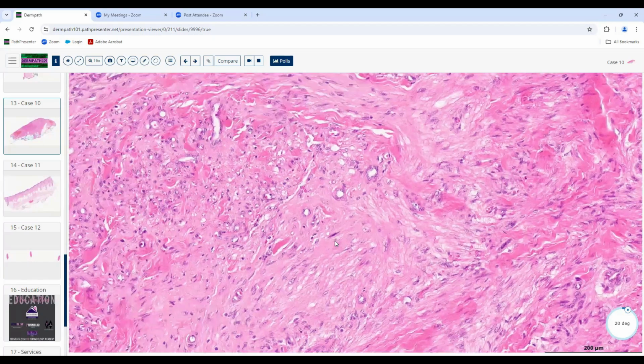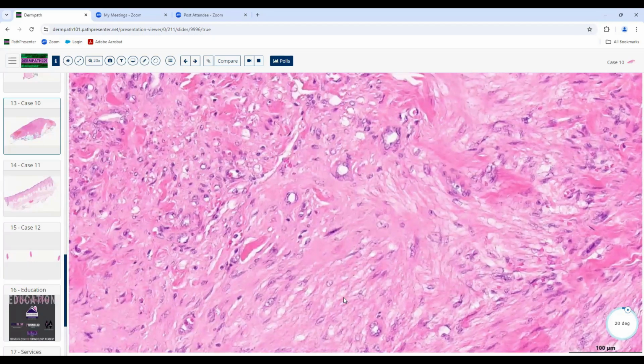If it's fibrohistiocytic, the cells are usually kind of angulated. They're not usually these delicate cells slowly spindling. If they're anything, they look irregular and jagged, and they form this zigzag kind of morphology. And if they're muscle, they tend to be blunt-ended, like cigars, like we see here.